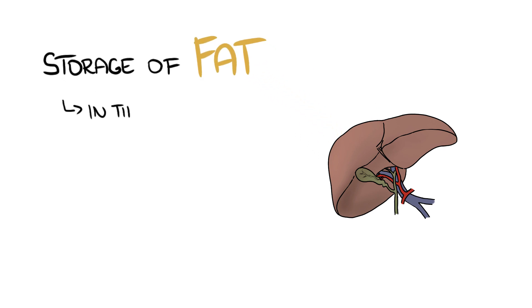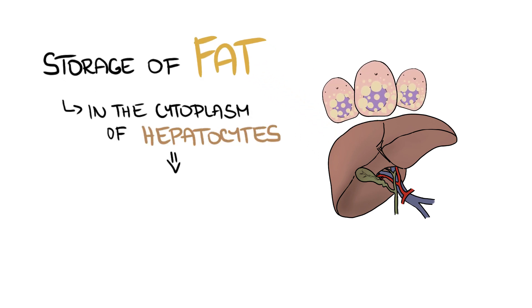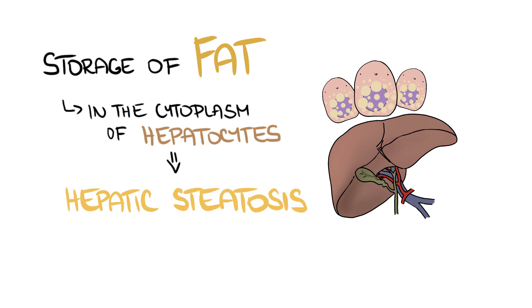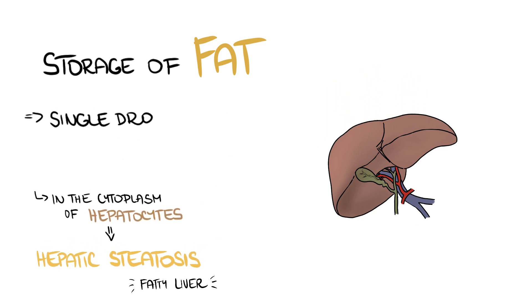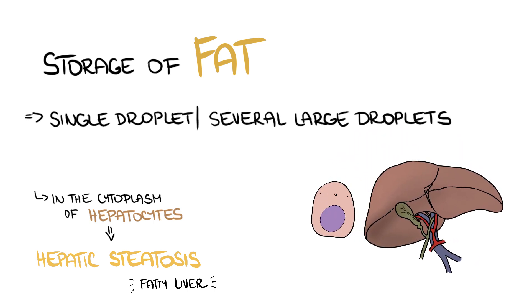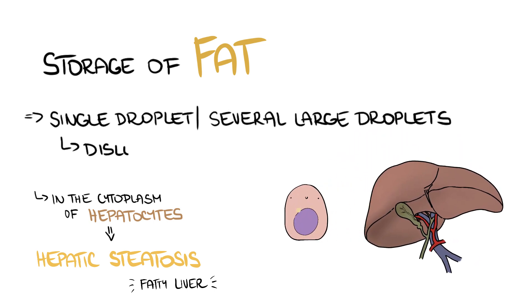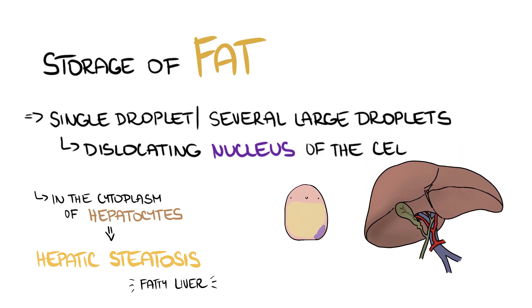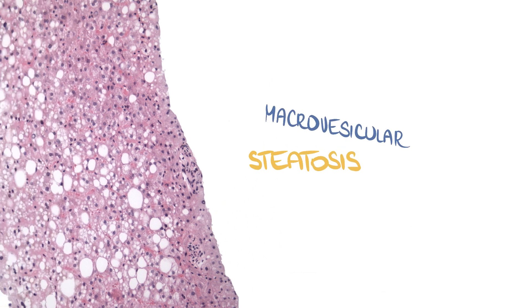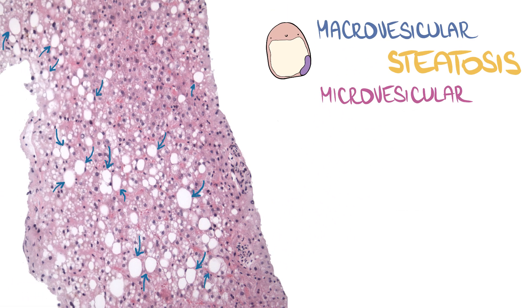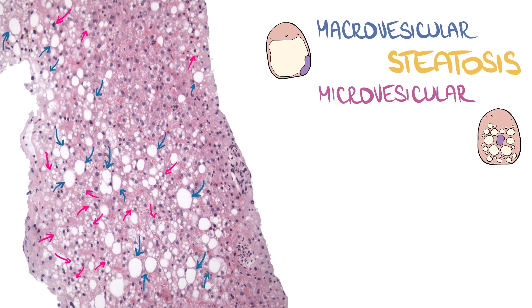Storage of fat in the cytoplasm of hepatocytes is referred to as hepatic steatosis or fatty liver. The fat can be stored as a single droplet or several large droplets dislocating the nucleus of the cell — this kind of steatosis is called macrovesicular. You can see it in the picture together with the microvesicular type, which will be discussed in a minute.